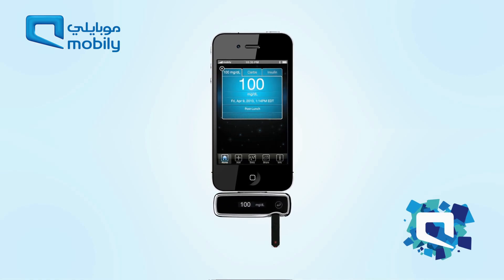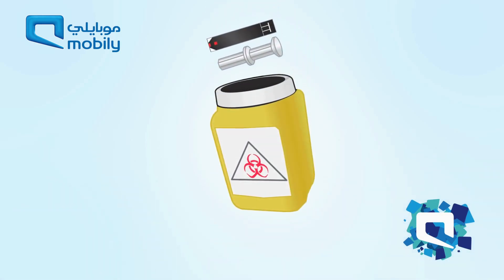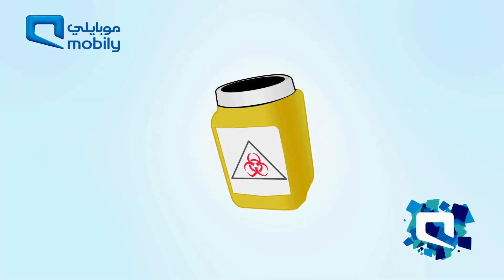Once the test is complete, remove the strip from the port, and along with the used lancet, discard according to local regulations.